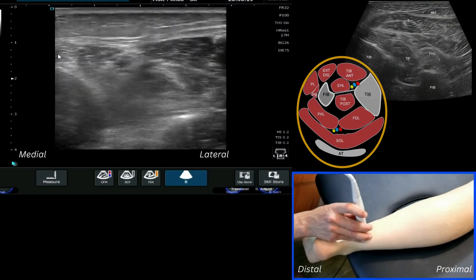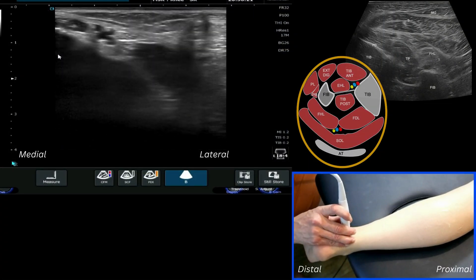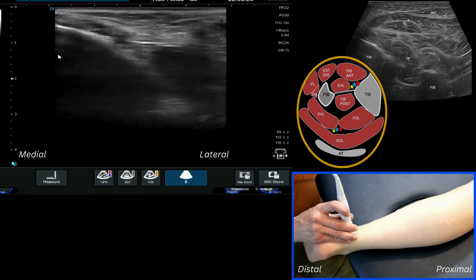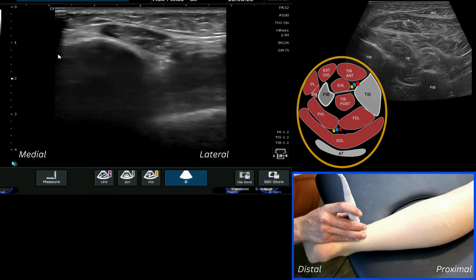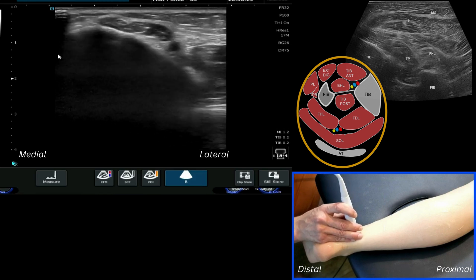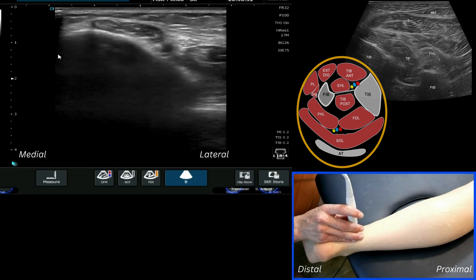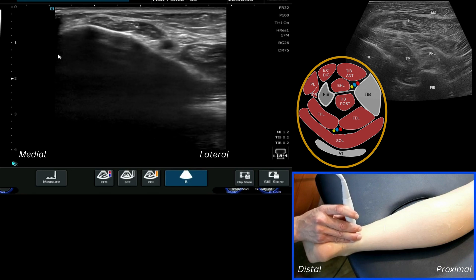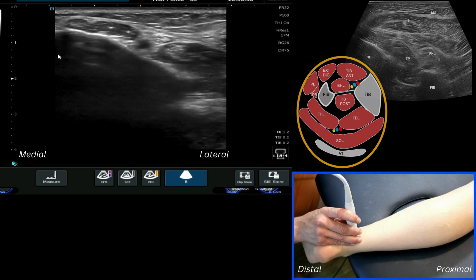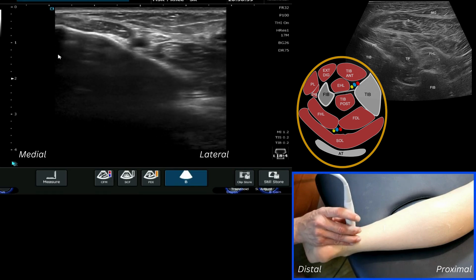This video looks at the posterior compartment of the lower leg. Specifically, we're going to look at the tibialis posterior tendon and muscle in the calf, the flexor digitorum muscle, and the flexor hallucis muscle sitting deep to soleus and the medial head of gastrocnemius.